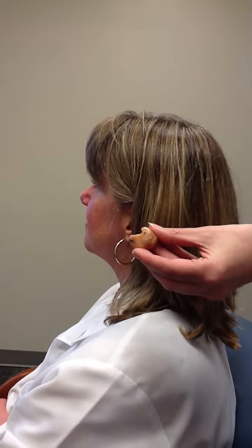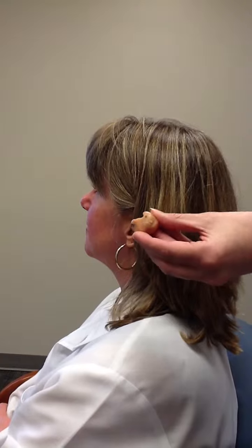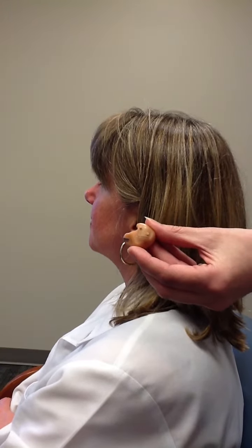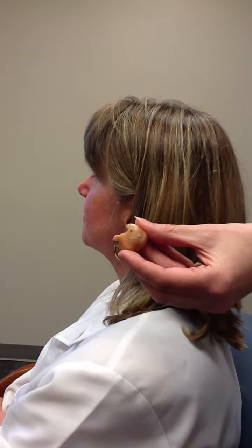In this video, we'll show you how to insert an in-the-ear hearing aid. The model I'm holding here is a type of in-the-ear hearing aid. The portion that's facing out is called the face plate, and that's the portion you'll see when you're looking at someone with an in-the-ear hearing aid.